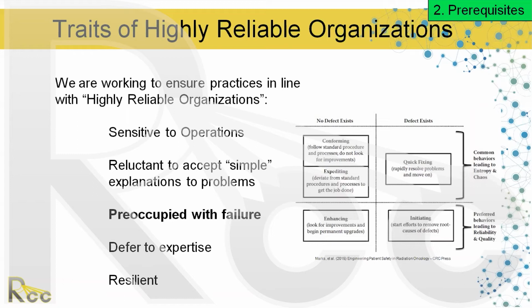I think radiotherapy has worked to become a highly reliable organization, or to adopt those styles. But these are the traits. So you're going to be sensitive to operations, so sensitive to the process and the system.